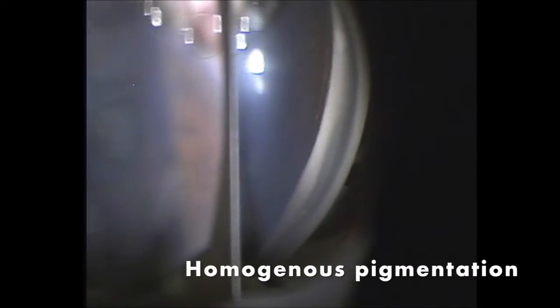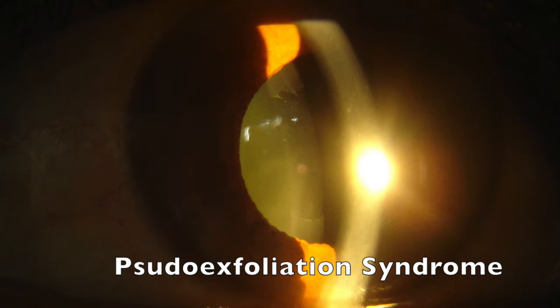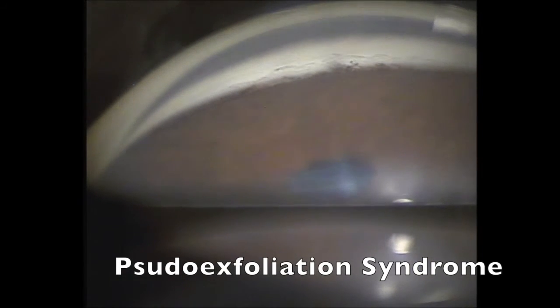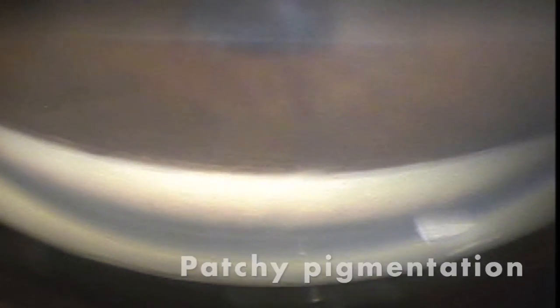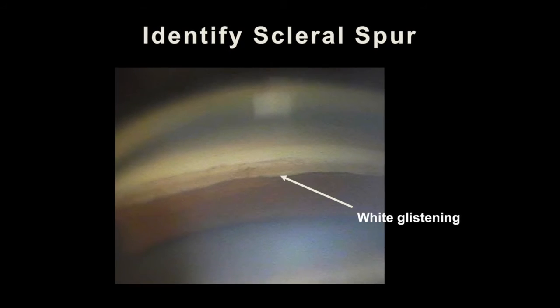A pigmented Schwalbe's line, or Sampaolesi line, may be present in pigment dispersion syndrome. In pseudoexfoliation syndrome, a scalloped pigmented Schwalbe's line is seen, called the Sampaolesi line. It is also associated with dandruff-like deposits in the angle and patchy pigmentation of the trabecular meshwork.